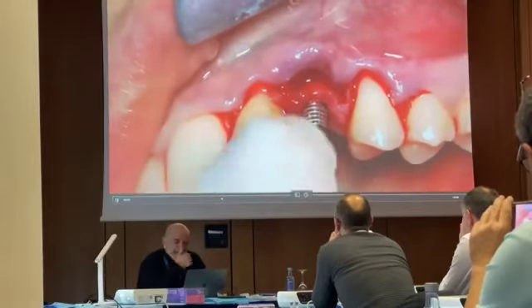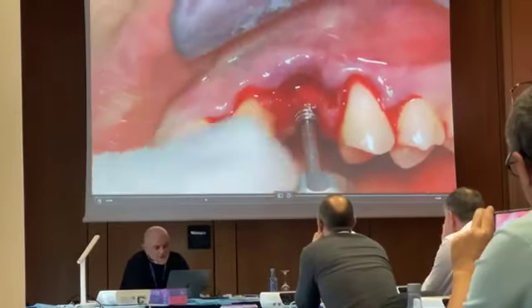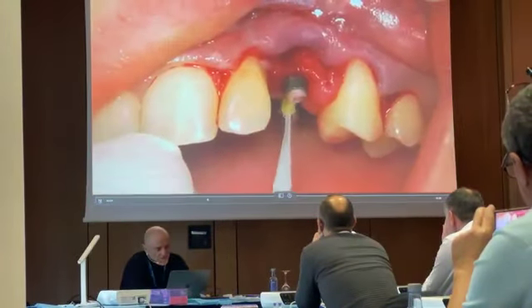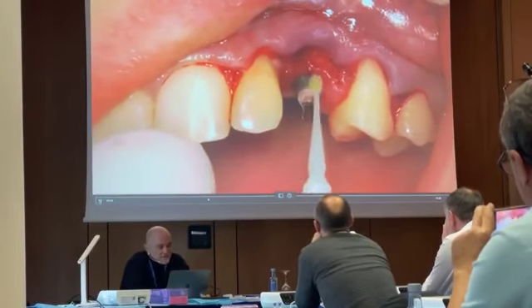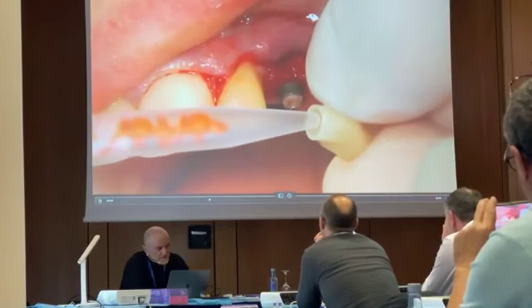Now we apply the, how do you call it, T-base? How do you call this? I don't know. The transfer for the temporization. We make in a few minutes the rebasement of the temporary crown.